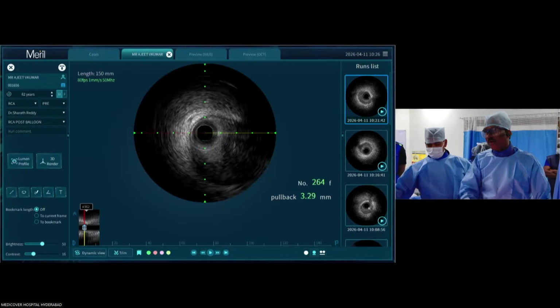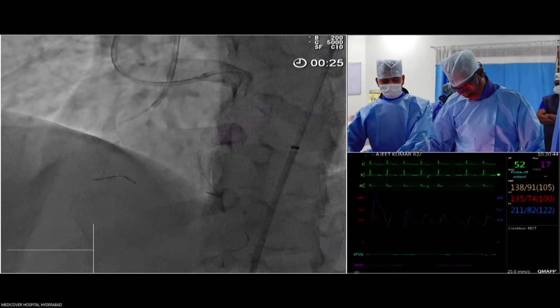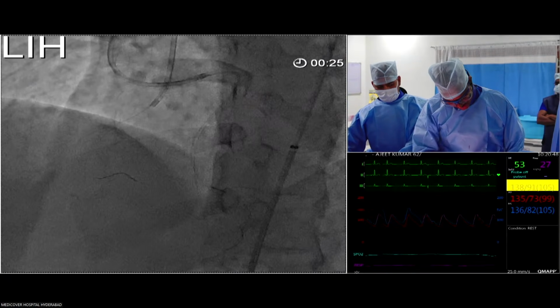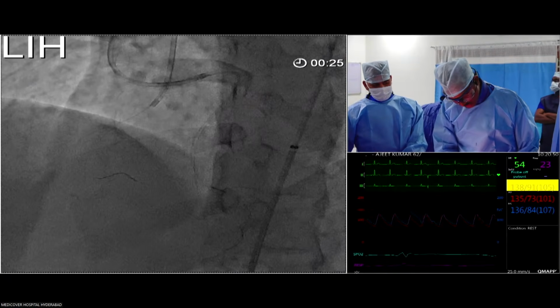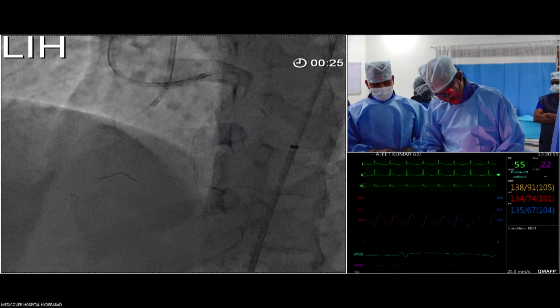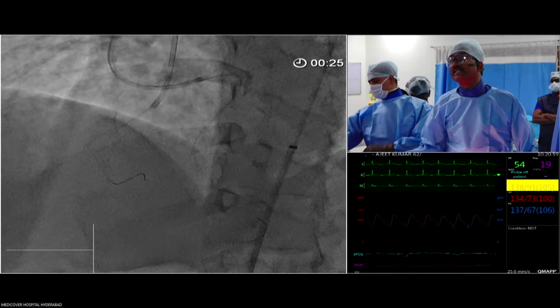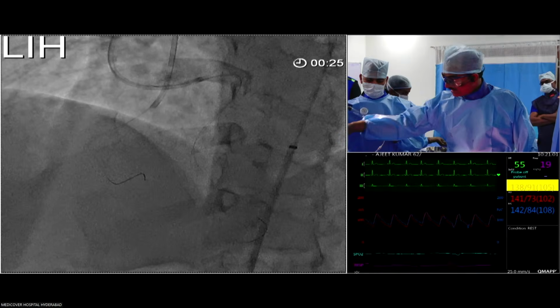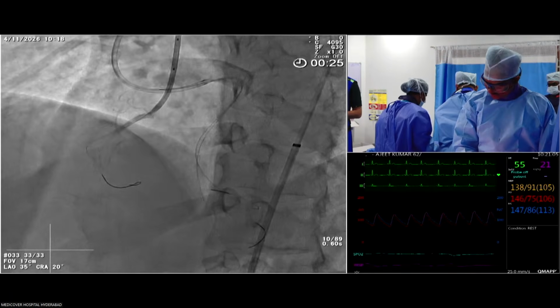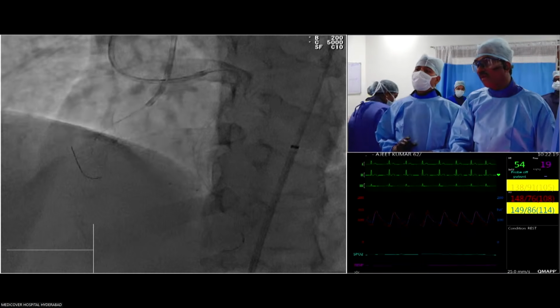Oh, it's okay. But here you can see in the angio, clearly there is kind of tunneling. That is not good. See, there is tunneling, if you can see. Show me the cine please. Show me the cine. Cine minus. Yes, I'm just dilating this area here.